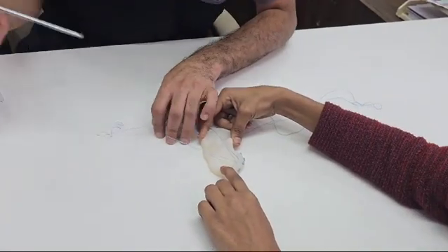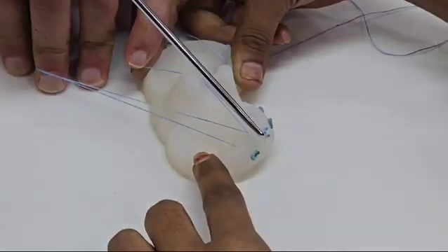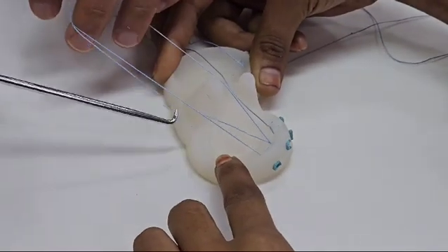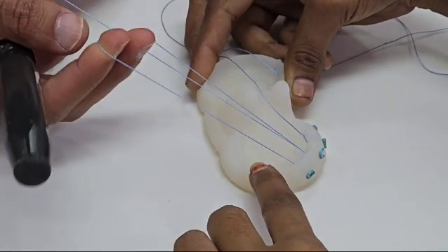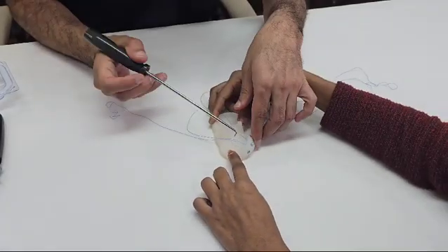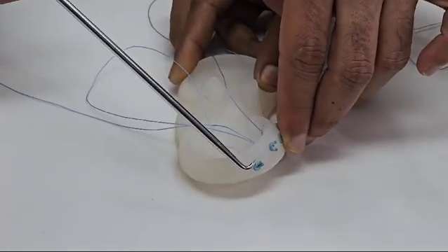When we do that, you can see that both of the meniscus implants are tensioned on the posterior part of the knee and it becomes an Omega. So you can see one Omega here and one Omega here. What we can appreciate is when you pull the outer bigger loop, the inner loop will cinch and both the implants will make an Omega on the back.